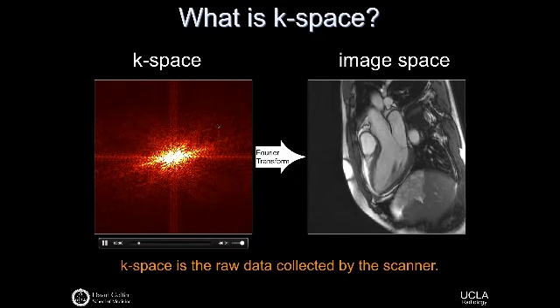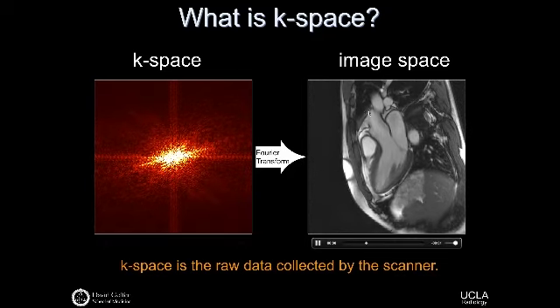And so we saw this example earlier in the previous lecture. And on the left-hand side, again, this is the K-space data. This is what we effectively acquire. And then there's some other steps as well, but the main step is the Fourier transform, which then produces an image that's hopefully diagnostically useful.